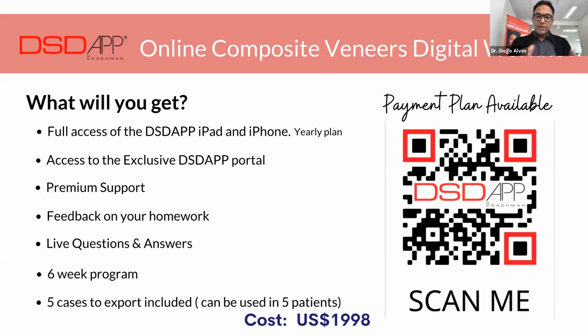So basically, you guys saw that I was exporting these cases from the app. When we say 5 cases, it doesn't mean that I can only export 5 files. It means that I can export files from 5 patients. Included in your package, you'll be using 1 case because that will be your homework, and that will be your real patient where we will be helping you. But after that, you can use it in 4 more patients, which is already included in your package.